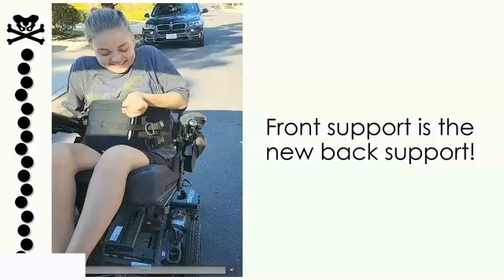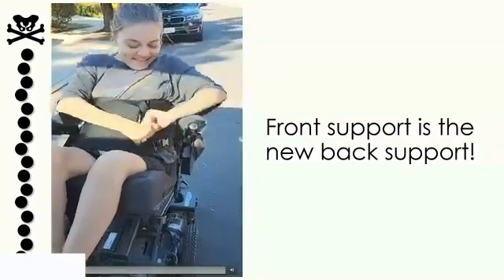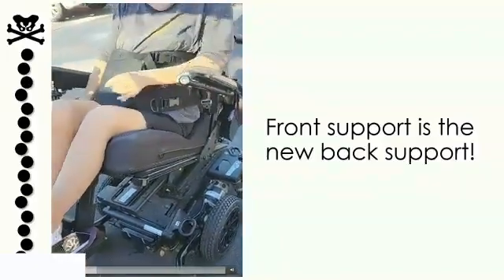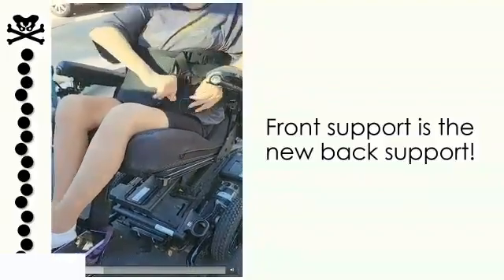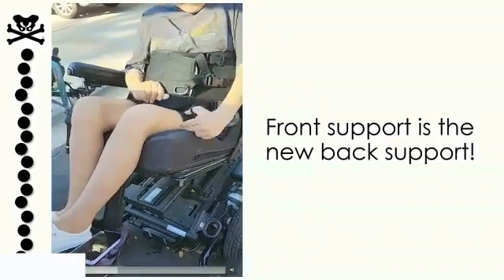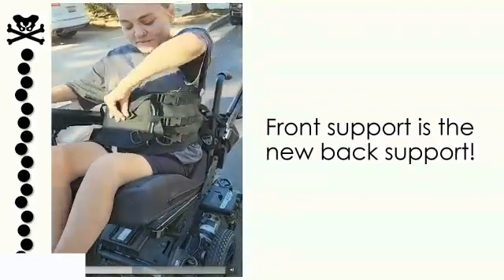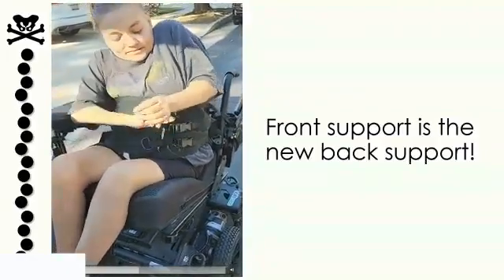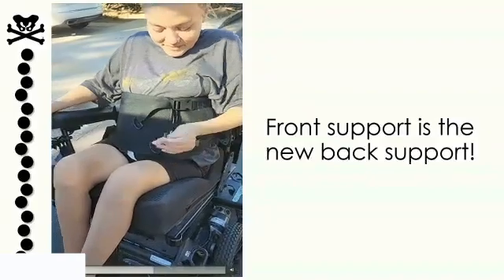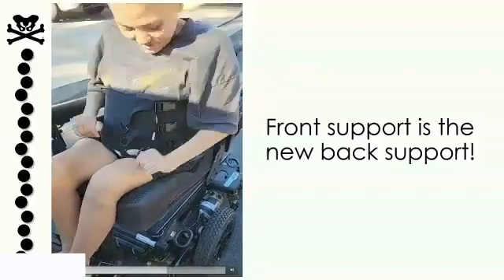So I'm going to play this quick video. I'm going to talk a little bit through the process. So this is her applying her abdominal support. The key thing I want you guys to watch in this video is what she does with her orientation relative to her abdominal support. So when she was not tight and she did not have the support providing support there, she was way back in her orientation, right? As she tightens that up and gives herself some support, she can come out of her tilt because she's now stable in that position. So this is a great reflection of the balance between the two.